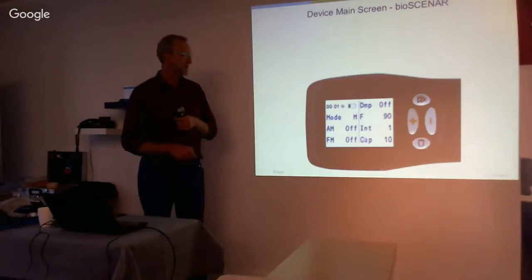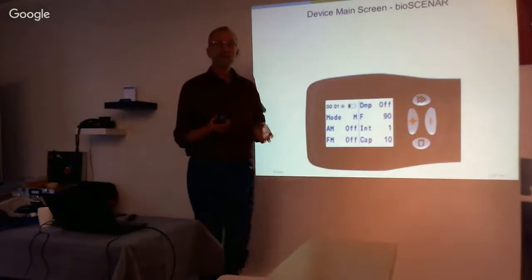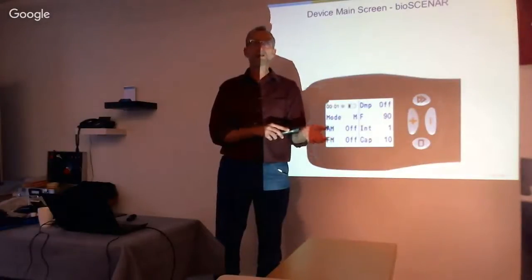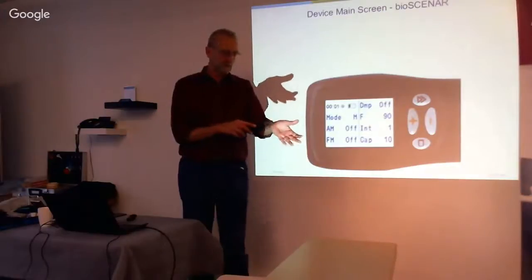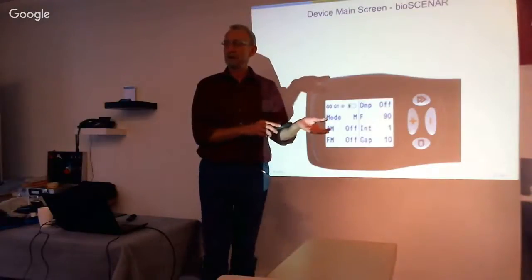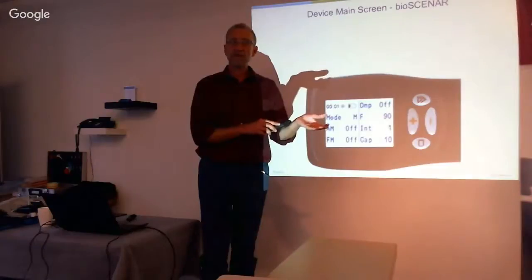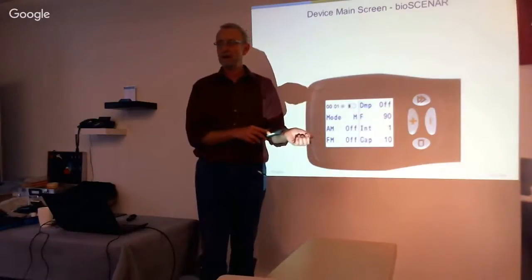All these functions are in basic settings here. And now you can start treating. It's turned on, you put it on the skin, and voila, you start treating. Now, what does that mean? What's happening now? Well, we are putting the device on there. It works with an energy of just 1, but it does something to the skin. It influences the skin underneath the electrode.